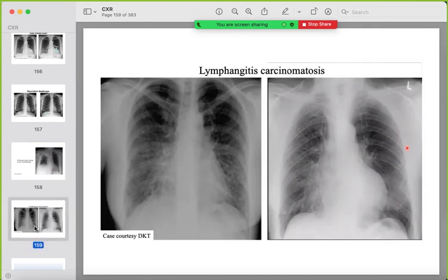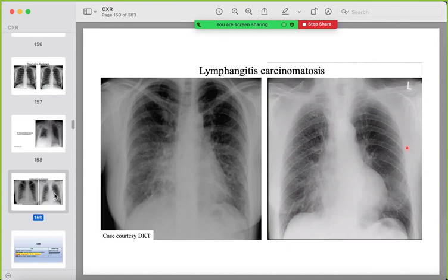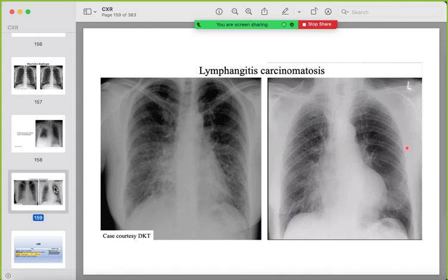Lymphangitis carcinomatosis shows reticular and reticulonodular changes reaching the pleural surface. Always look for previous imaging and clinical history in such cases.